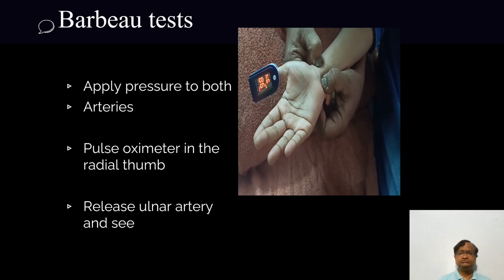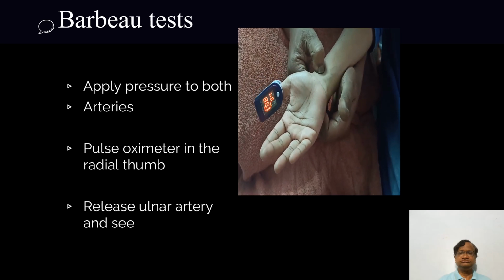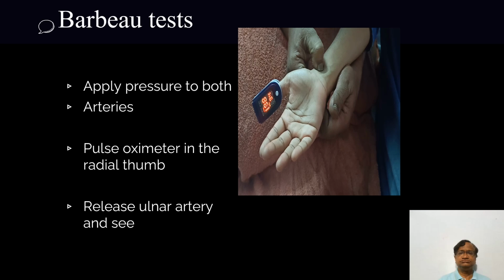Now you can see the pulse oximeter signal is gone. Now I am releasing the ulnar. Okay.